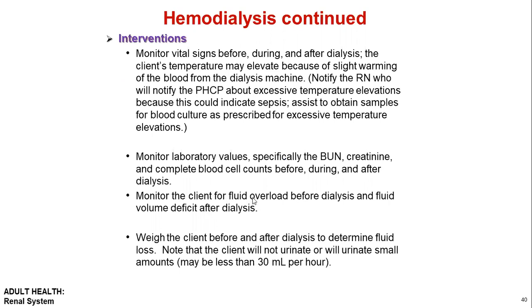Monitor the client for fluid overload. As an RN, every day we check the patient's body weight, right? Especially with dialysis, before and after. So before and after indicate how much fluid is lost or removed from the body.